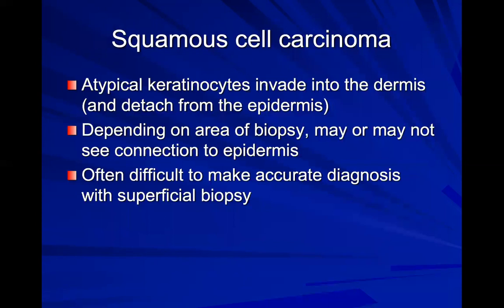Okay, moving on to squamous cell carcinoma. Now, just like squamous cell carcinoma in situ, squamous cell carcinomas have very different morphologies. Their definition is when atypical keratinocytes invade into the dermis, and I use it for when they detach from the epidermis, though others will use when it's just thick enough to be down in the reticular dermis.